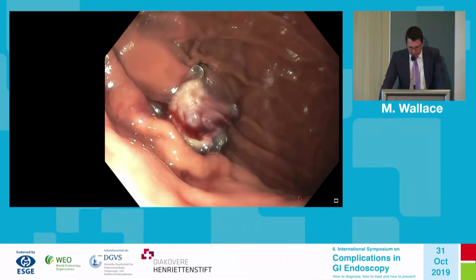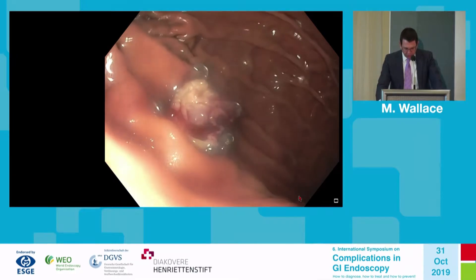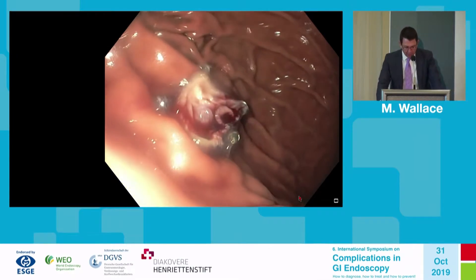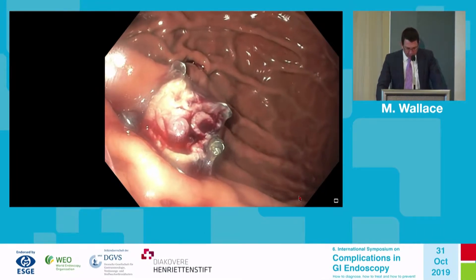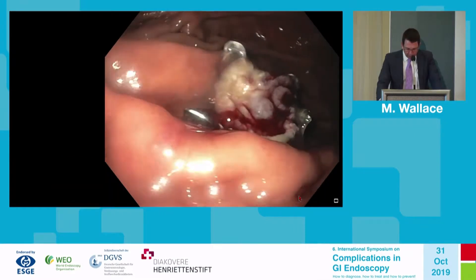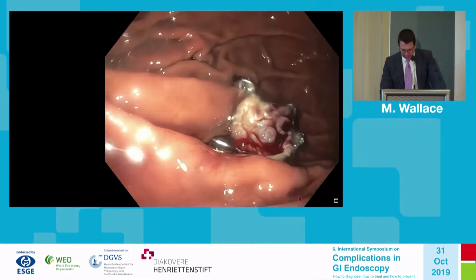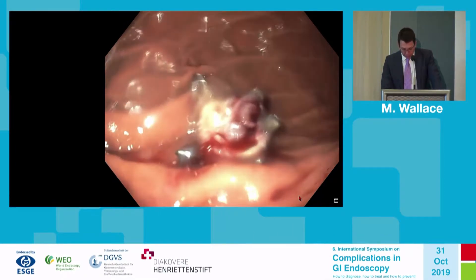Here is the deployment of the device — this is the proper view. You can actually see the extragastric fat, confirming that this is a full thickness resection. It shows the inverted layers of the gastric wall, confirming a proper complete closure and resection.